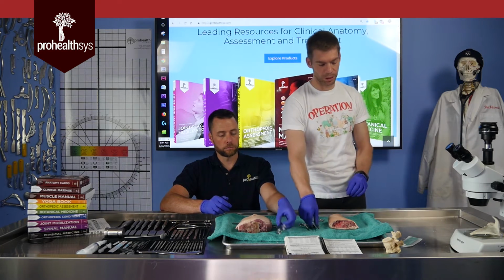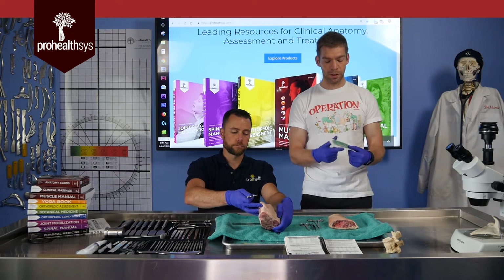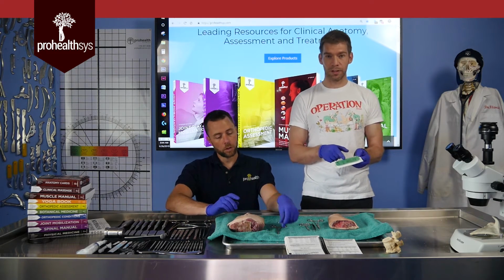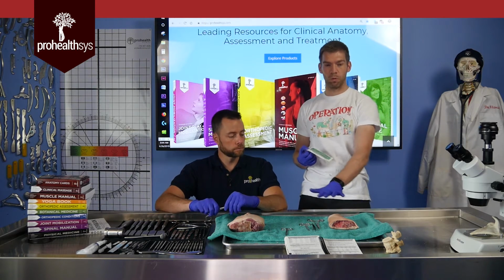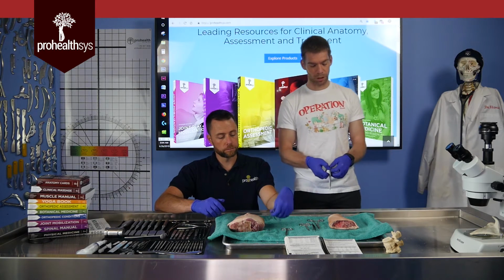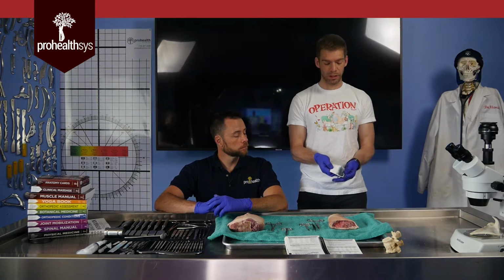So the last thing that we need, of course, is your needle and thread, your suture. The outside of this package is not sterile. The inside of it is. So I'm going to open this package up, and I'm going to pretend this whole field is sterile. I'm going to open the dirty package up away from the sterile field. And now the inside of this package is sterile.